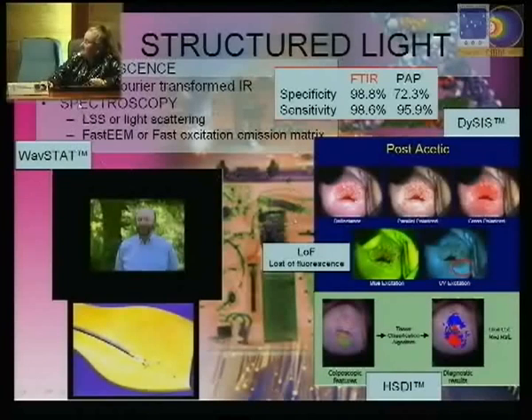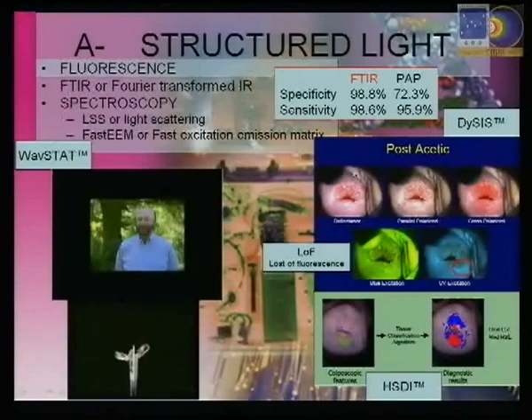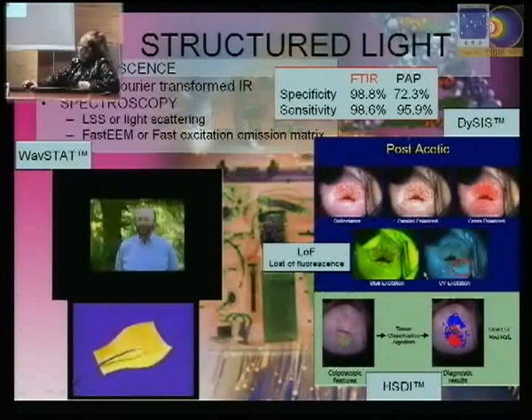Plus this, which is non-image data, it is also called spectroscopy when you use different colors, so that means different light spectrums or different image responses from the tissue. They call it also spectroscopy, although no, it's not the classical spectroscopy, it's another type of spectroscopy, which includes also the images. The classical ones are these ones.